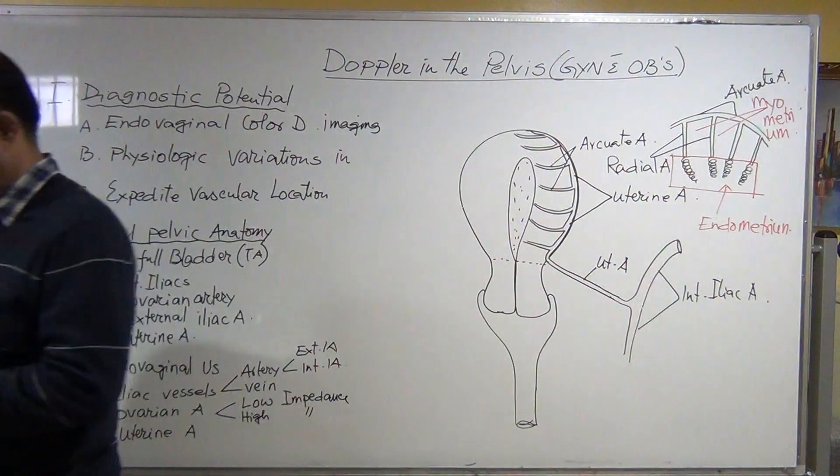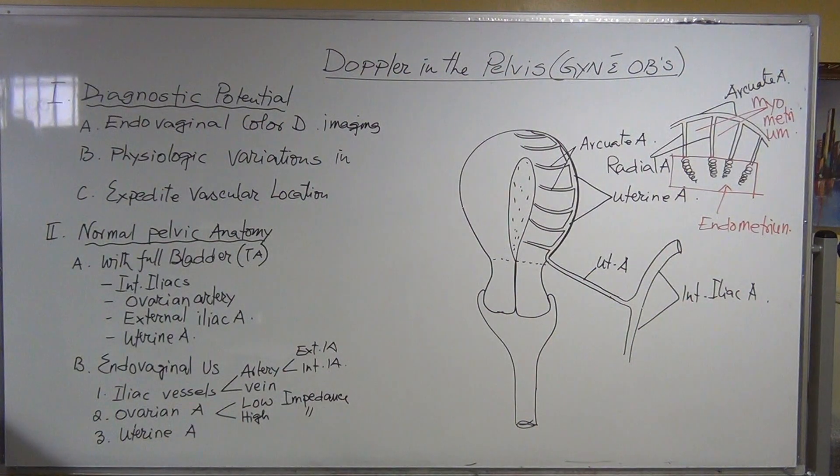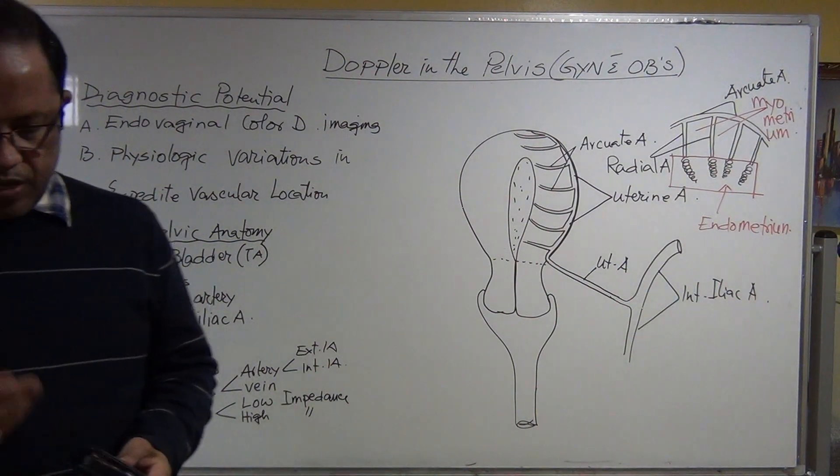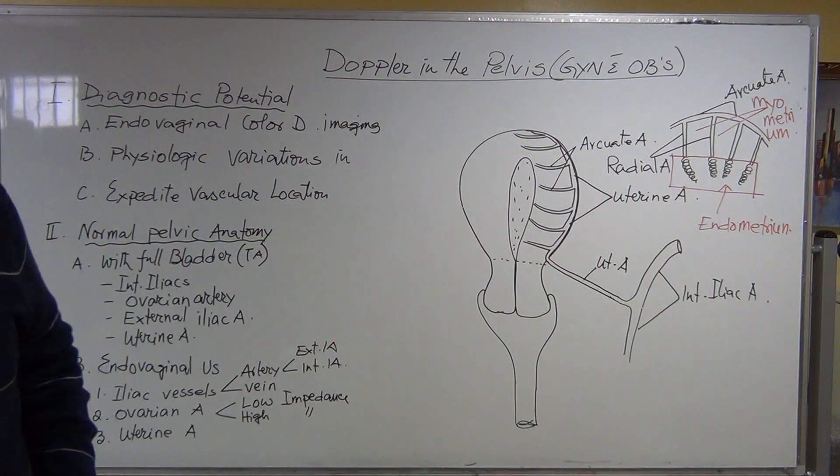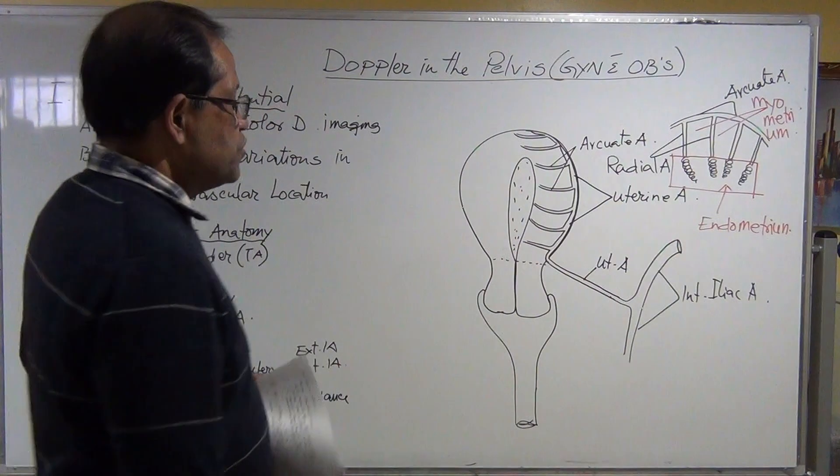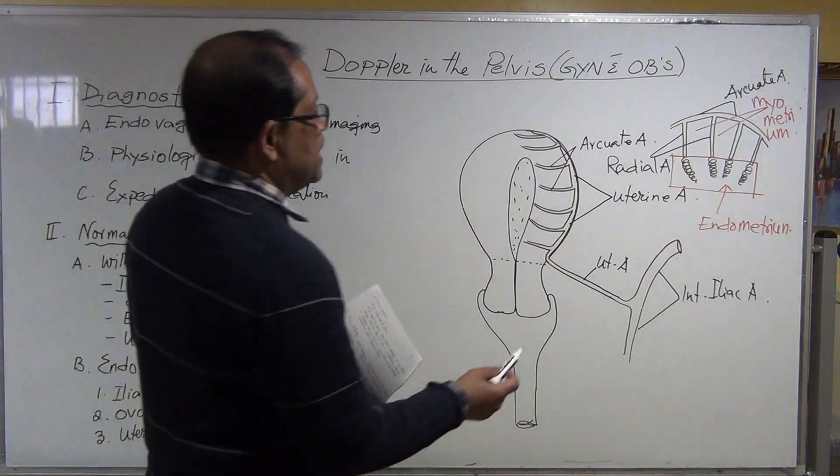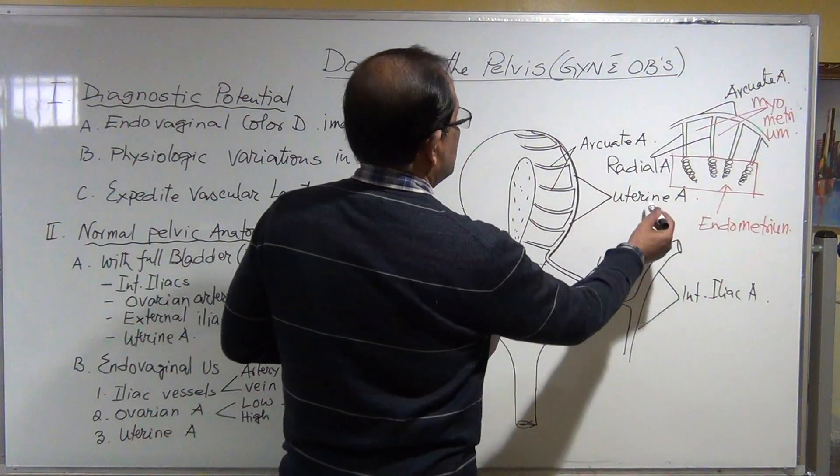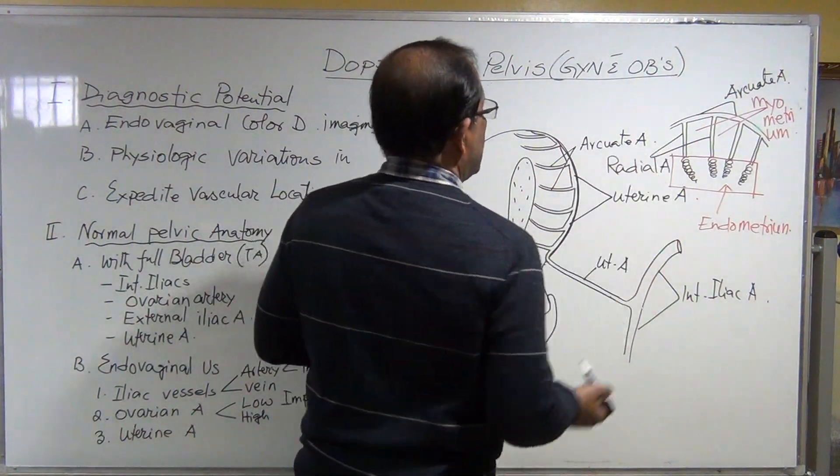Now this is the arrangement of the uterine artery. We need to evaluate this part of the uterine artery, this part of the uterine artery, and we can evaluate the arcuate artery.